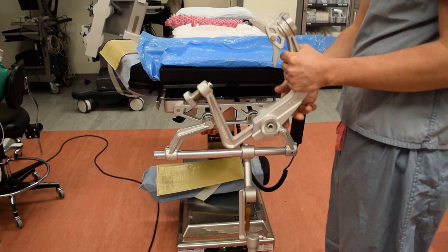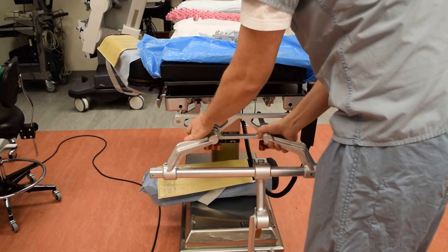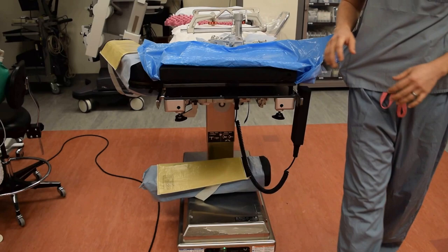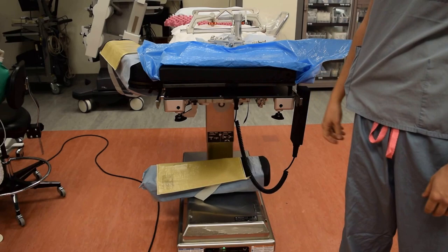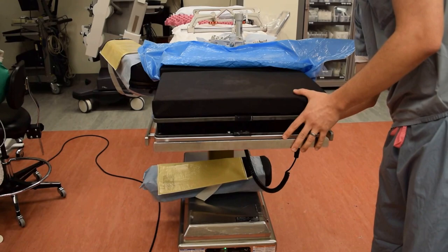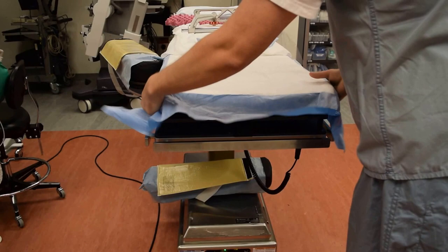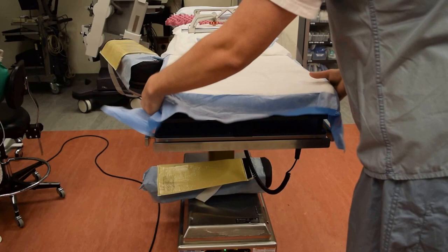You would then unlock the bed adapter as a unit and pull the whole piece out, placing it in another part of the room away from the patient's bed and out of the way of anesthesia. We're going to grab the original piece of the bed, put that back in, and lock the two black screws in place. Then place the sheet back over this. Anesthesia may want a pillow, and then the patient's head can go back on and they can be ready for extubation or transfer to the ICU bed.